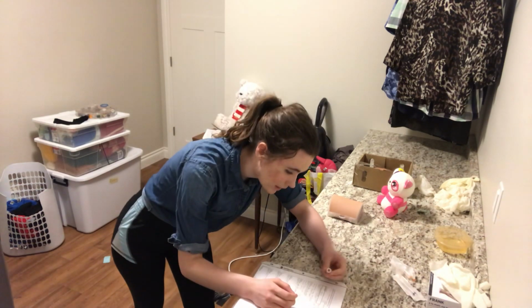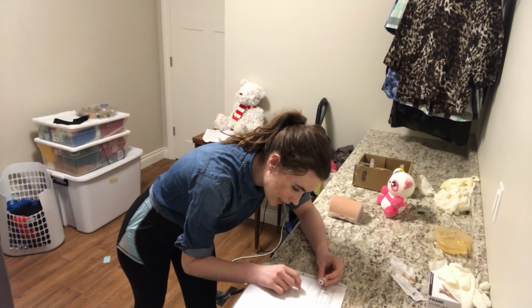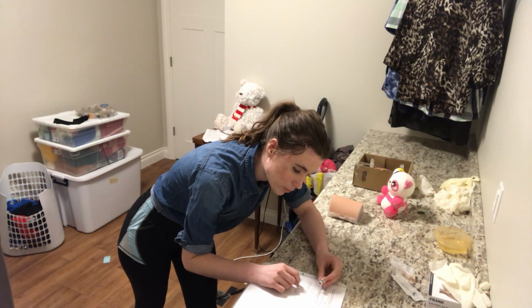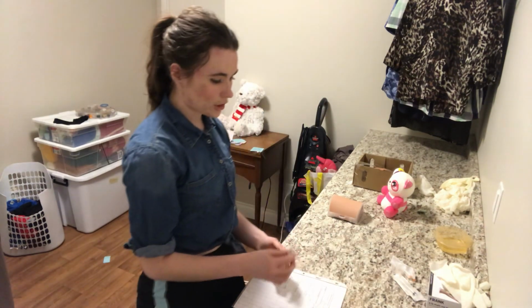So I have selected out heparin, which is 5,000 units per 0.5 ml, so we're going to be drawing up 0.5 ml. And I see that it is a single dose vial, so we're going to be discarding the vial once we've withdrawn the medication. We can give it subcutaneous, and it is not expired. So this is the correct medication to give.